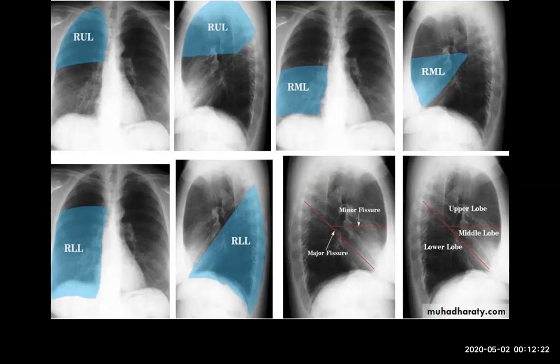On the right side, we have the right upper lobe — which occupies this area — the right lower lobe, and the right middle lobe, according to the transverse fissure, the oblique fissure (major fissure), and the transverse (minor) fissure. The middle lobe is located anteriorly in the lower part, just below the minor fissure, and the major fissure divides the upper and lower lobes. These are important concepts.